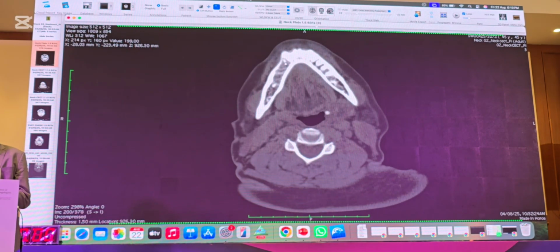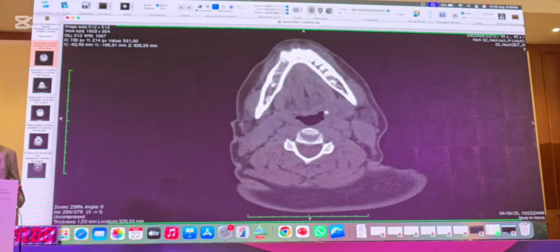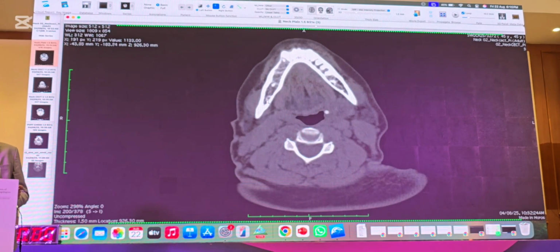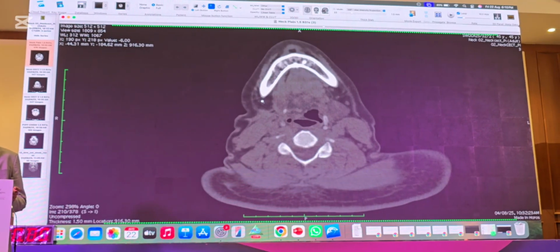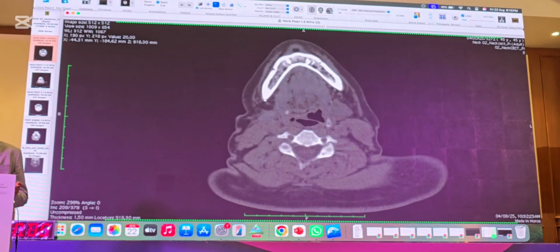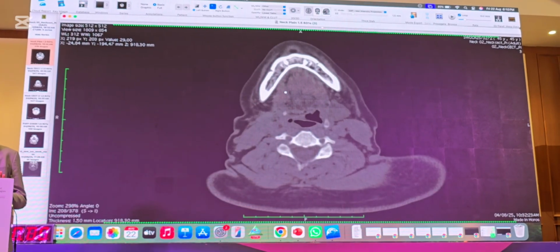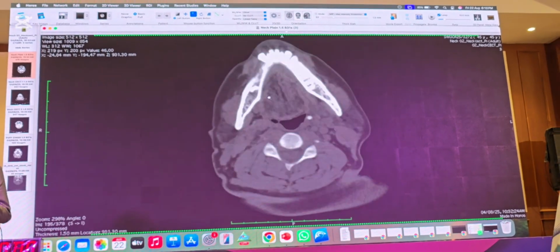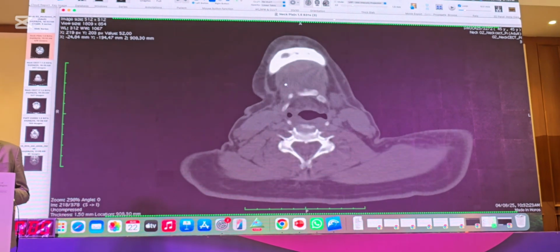And you can see what is the structure? The foramen for the inferior alveolar nerve, and you can see how it exits through the mental foramen. Okay, so the mandible looks normal, and the hyoid comes.